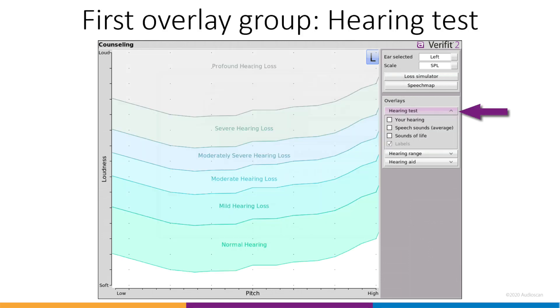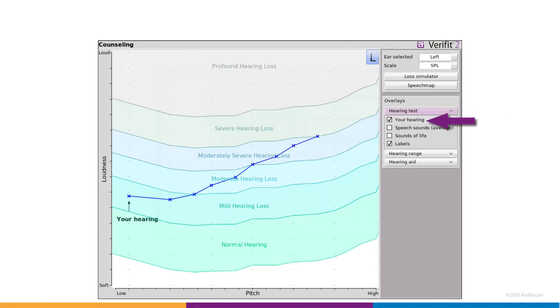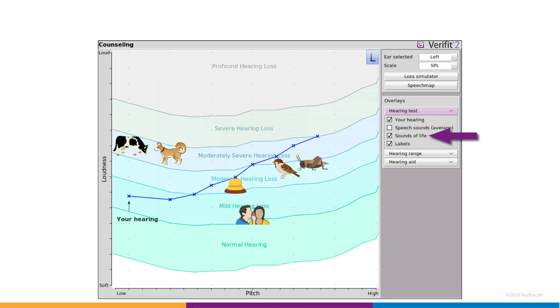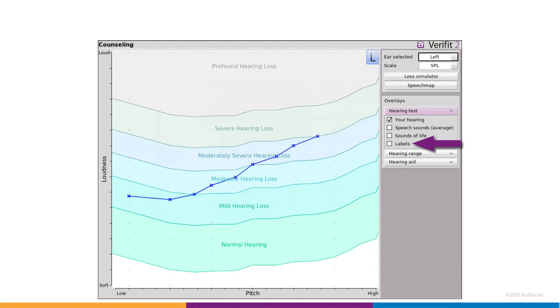The first group, hearing test, allows you to show the audiogram with a severity of loss overlay. We also provide an overlay of speech sounds and an overlay of sounds of life. In all three overlay groups, you can toggle on and off the curve labels as well.